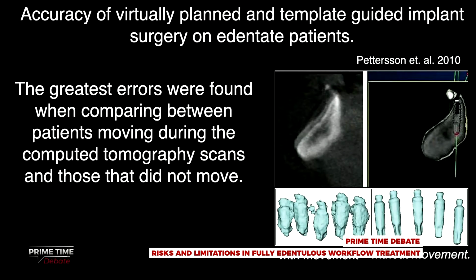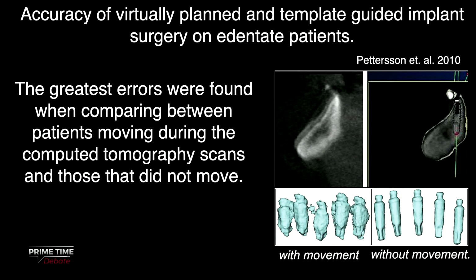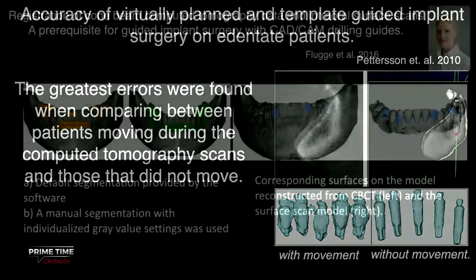If the patient moves, you end up with this kind of picture, and you can appreciate that if you have these kinds of images, you cannot really do anything. I mean, your acquisition is poor, and that has an effect on your outcome.